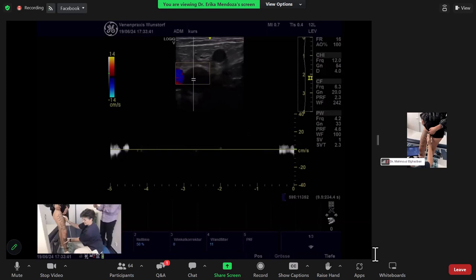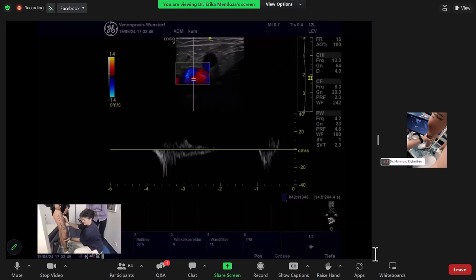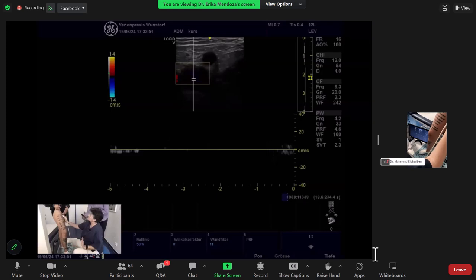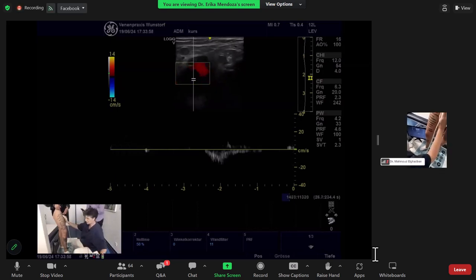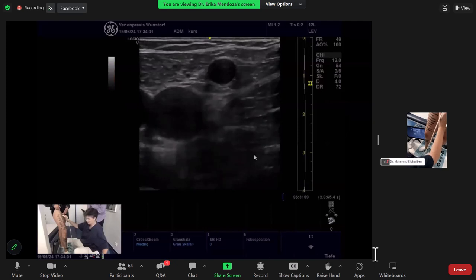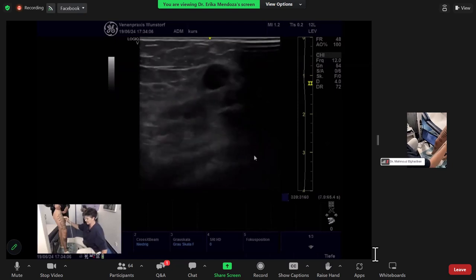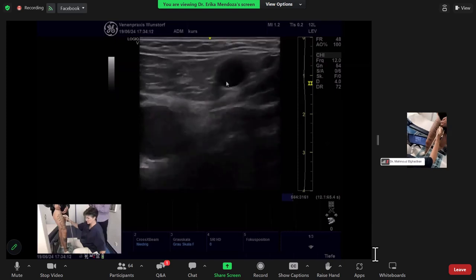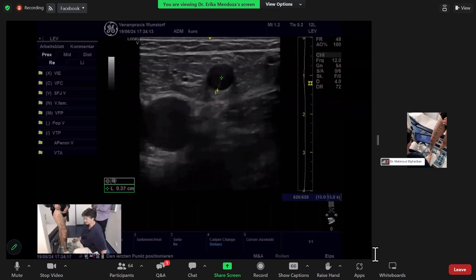I make the calf compression, decompression, and we can make another thing. Lift your toes up. And, exactly, again, perfect. This was the Valsalva maneuver. And as you are seeing while I'm doing it, we see two things. When we look at the leg from the outside, we would think there is not so much happening inside. But you see this vein is rather large, we can measure it. It's larger than expected at that point.